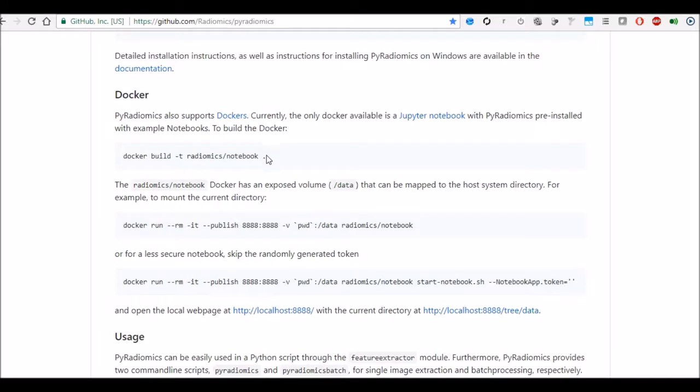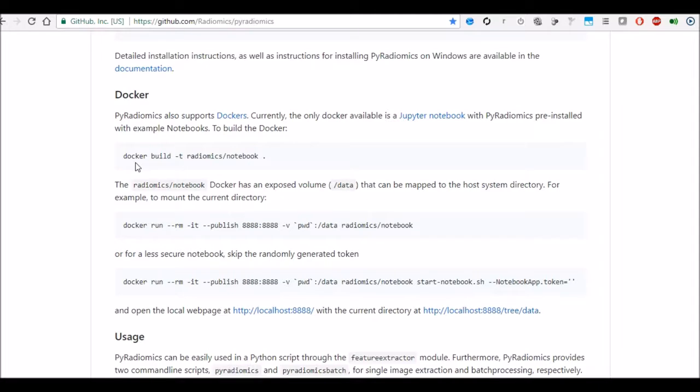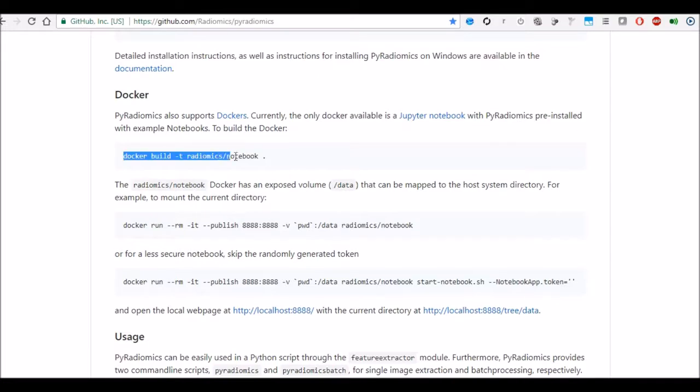So if you use this route then you need to have virtualization ready machine. So under windows 10 you can reboot your machine, go into the bios setting and enable the virtualization. Once you have the virtualization done then you will have to install docker itself on your machine. You can do that by google searching docker and it will provide you the docker directory and you install it.